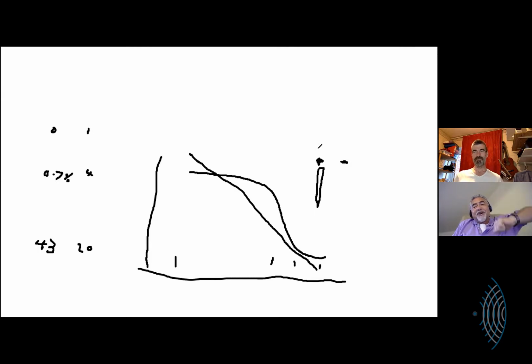But you're saying if I went strictly to B mode and took the compounding off, I could at least be assured that I would be able to tease out what part of it is posterior acoustic shadowing. Yes, that's the idea.